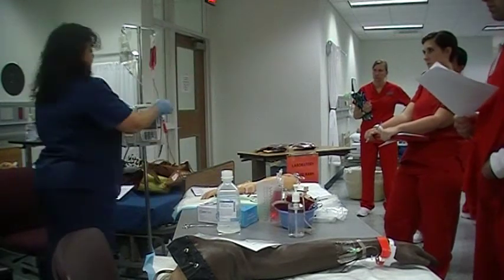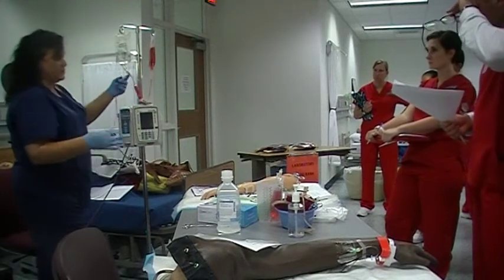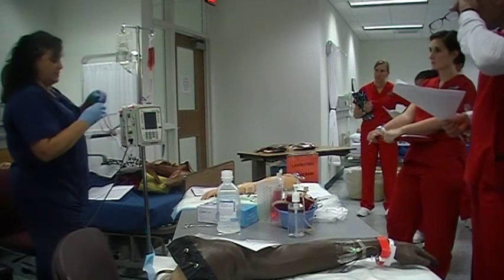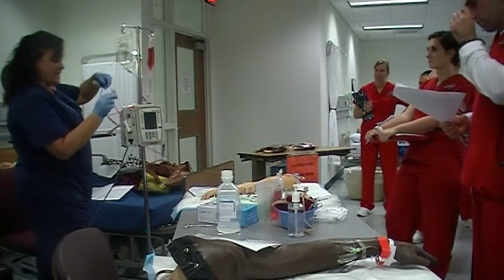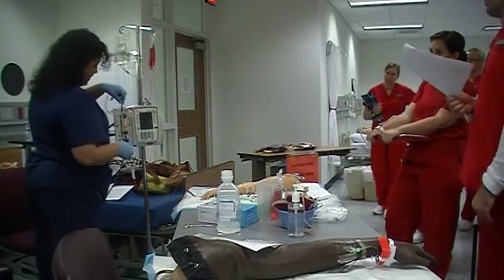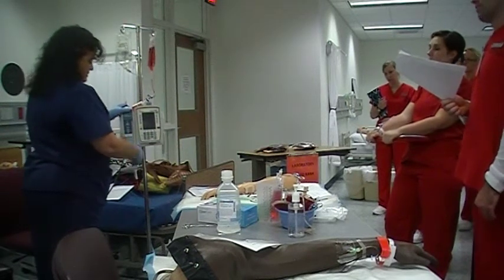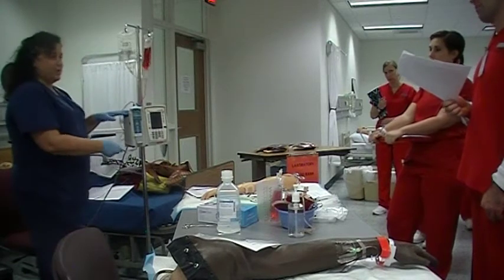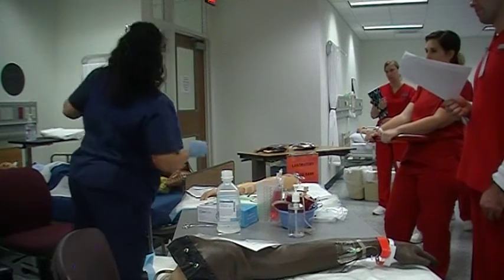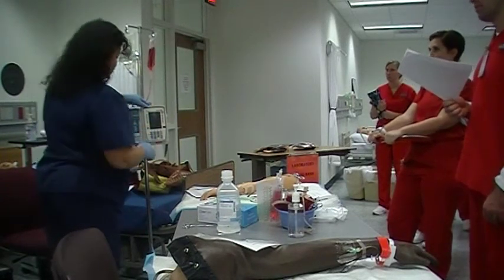All right, so we have our blood. With the Alaris pump to be, you guys are going to be responsible for doing this correctly too, okay? So make sure that you practice that. You're going to open it and you're going to put the blue cassette in. The long way goes in until it clicks. And then you gently lift it up until that disc rests in the top. Close it. Now once it's in the pump, you can open everything so that you won't forget to. You only want to open your blood, not the saline. Okay, once it's done, you turn on the pump.